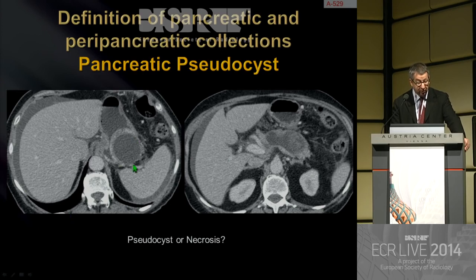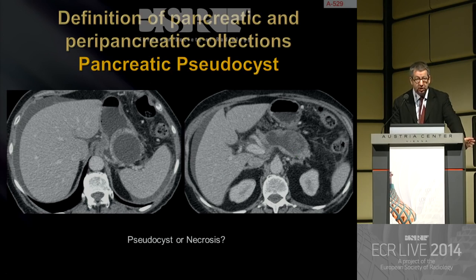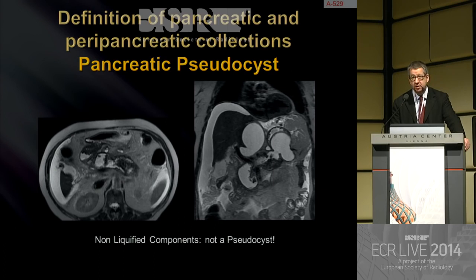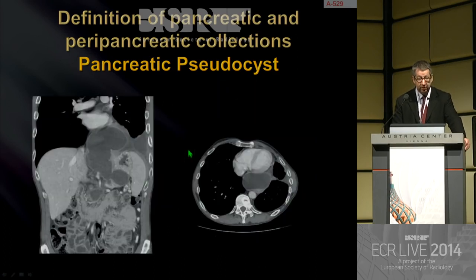Here it looks like a pancreatic pseudocyst at CT — round shape, enhancing wall, homogeneous. But in the same patient, around the pancreatic body there is something much more heterogeneous. MRI is clearly a problem-solving technique because it is not a pseudocyst — it is a necrotic collection with solid components, which is clearly seen. And here too it looks like a pseudocyst, but there are solid components inside the lesion, confirming it as an acute necrotic collection.